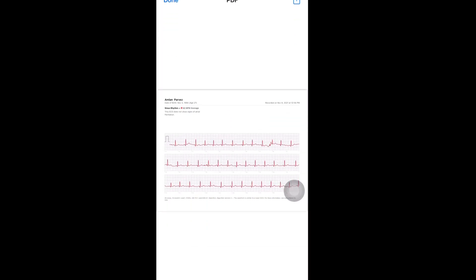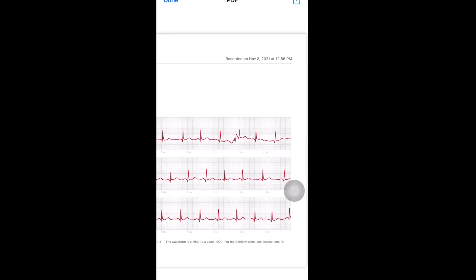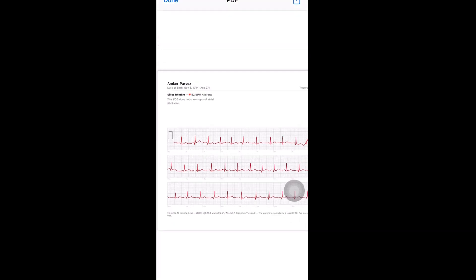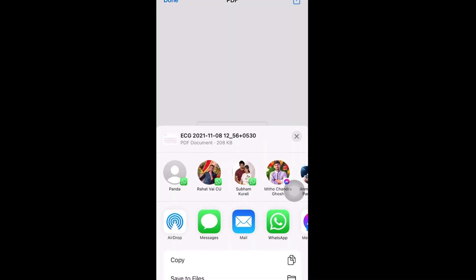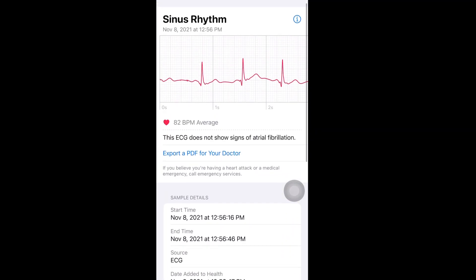One more thing: during ECG, when you take the measurement, don't move your hand or yourself, and then you will get a perfect ECG measurement. Now I will show you how to enable the ECG feature in your region on your Apple Watch.